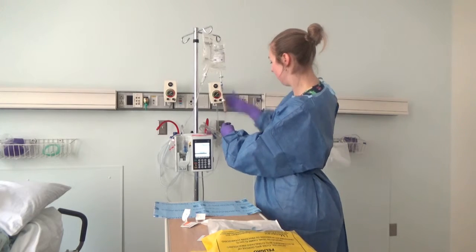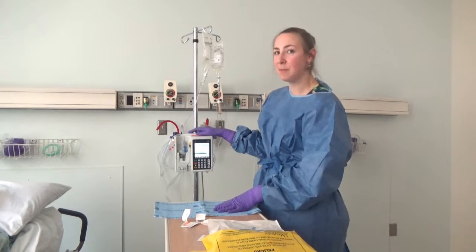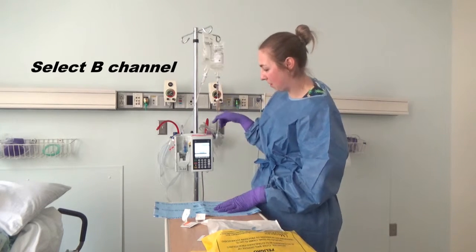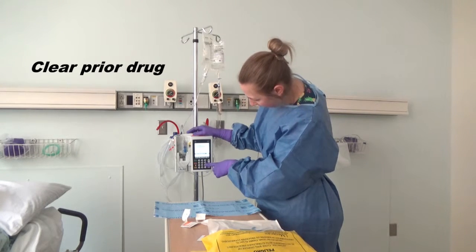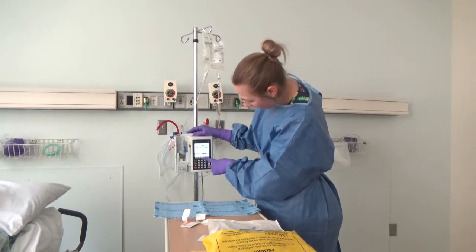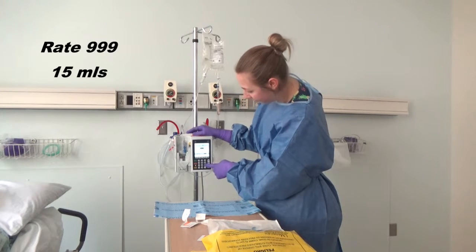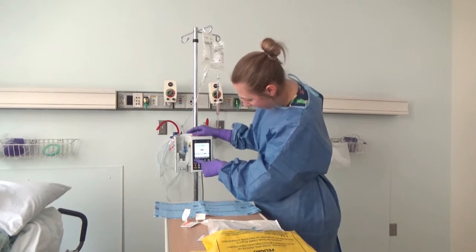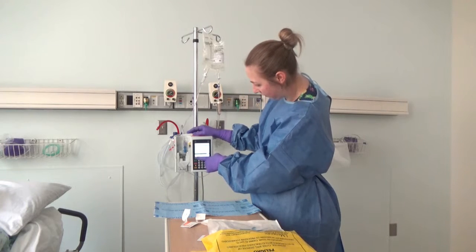Then hang it, unclamp, and I'm ready to prime the B line to get ready to give the chemo. I'll go to the B line, clear my settings from the Rituxan, and select IV maintenance fluids. Our rate is going to be 999 for just 15 mLs to make sure that the chemotherapy is at the end of the line when we actually go to start it.